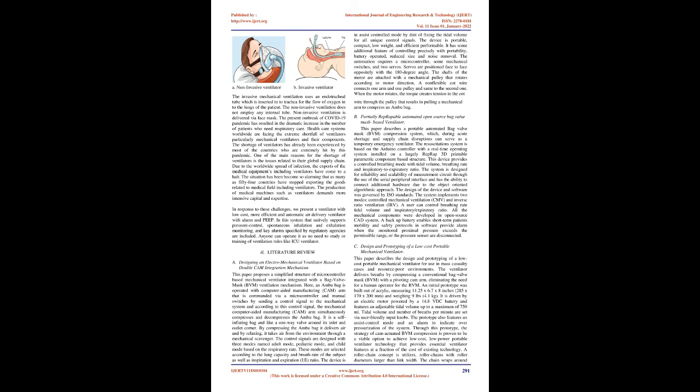The lungs of the patients who require mechanical ventilation due to COVID-19 are so much inflamed that the oxygen is unable to reach the alveoli when a patient breathes, and the mechanical ventilator acts to force the oxygen flow under pressure to these small air passages.